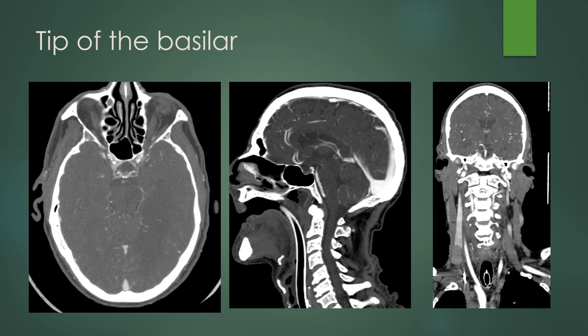This is an appearance of a tip of the basilar infarct. On the CTA image, you can see clot at the tip of the basilar and at the origin of the left PCA. On the sagittal CTA view, you can see the clot just at the tip of the basilar, and on the coronal view that filling defect is the clot at the tip of the basilar artery, extending more into the left P1 segment but showering small clots to the right as well.